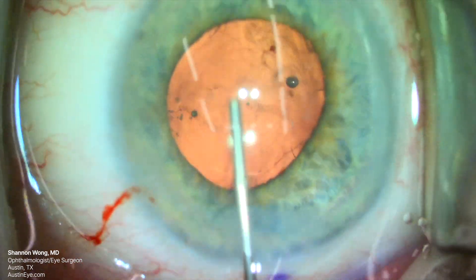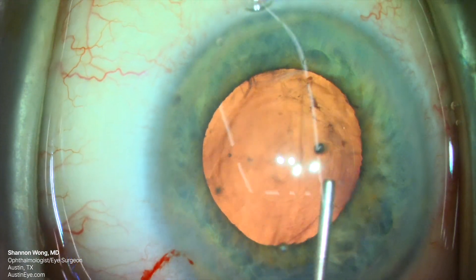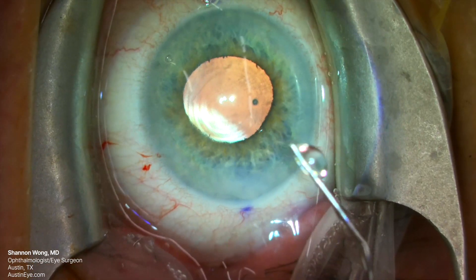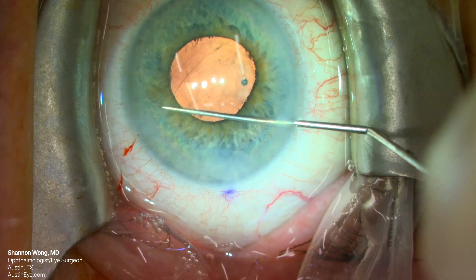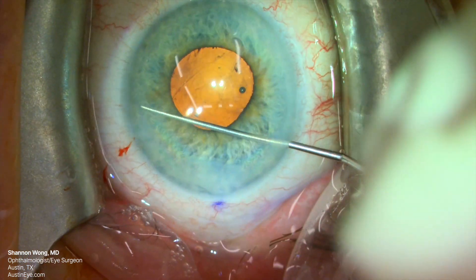We're not referring this patient to retina today. We still need to remove the Healon GV from the anterior chamber, so we methodically and gently flush the anterior chamber with BSS on syringes through a 27-gauge cannula. Once the viscoelastic has been flushed, we hydrate our incisions, then use a cyclodialysis spatula to sweep the pupil and the incisions to make sure there is no vitreous prolapse.